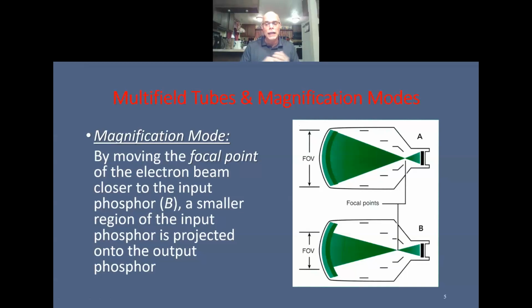Remember, because you're getting less information pushed out through the same number of pixels. Same number of pixels are going to be over here connected to the monitor. We haven't talked about the. Remember, we stopped where the actual billions and billions of light is coming out of the output phosphor. That's where we stopped, but they added the monitor here because we'll be covering that later on.